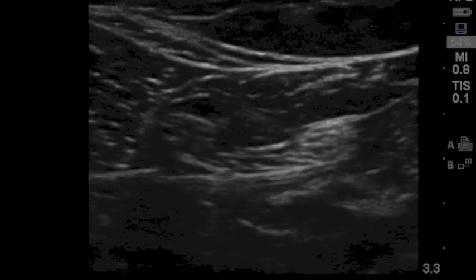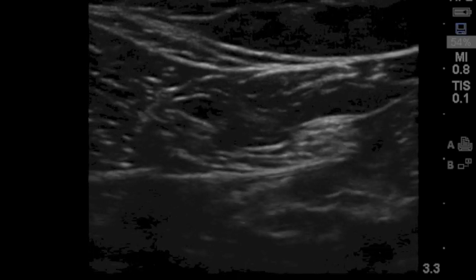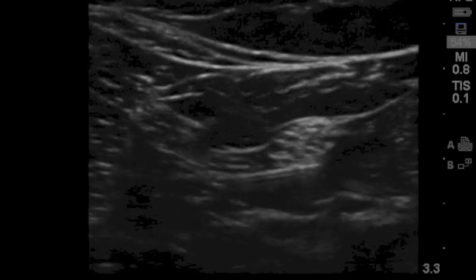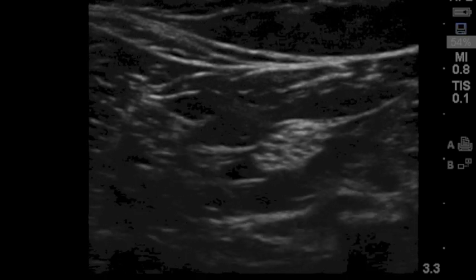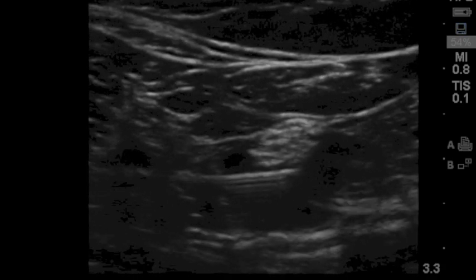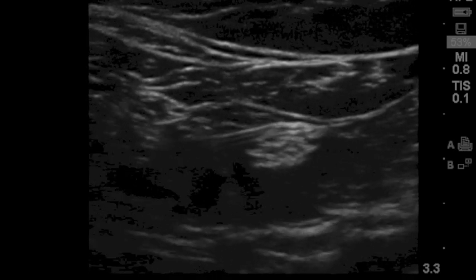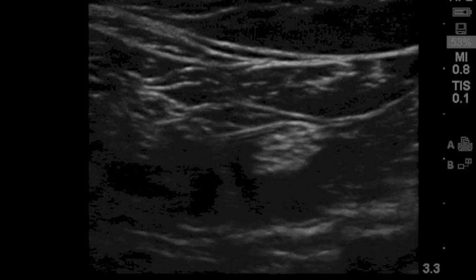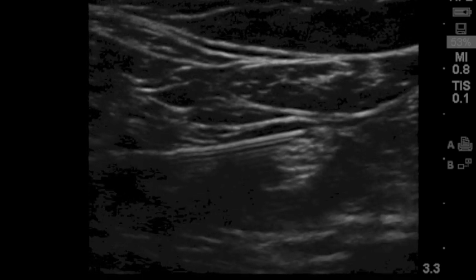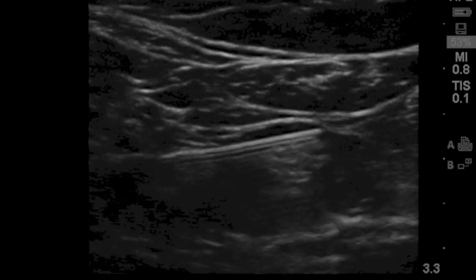Once we're underneath the nerve, I'm going to make sure that there's no paresthesia as I begin the injection. You can see the local anesthetic filling underneath the nerve as we do our injection. I like to see nice pooling around and the nerve slightly rising underneath it. Once I'm satisfied that I have a nice amount of injectate there, I'm going to slowly redirect the needle to try to get on top of the nerve to ensure good filling and circumferential spread around it — so you'll almost see a whole circle of local anesthetic surrounding a nerve that sits in the middle. In all, in most blocks that we do, we use about 30 milliliters of local anesthetic to do this block.